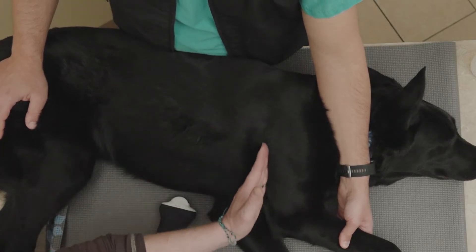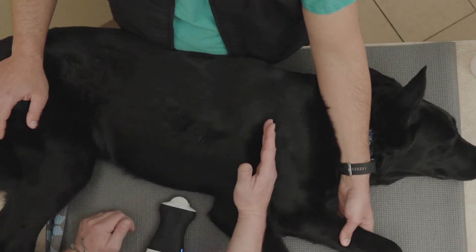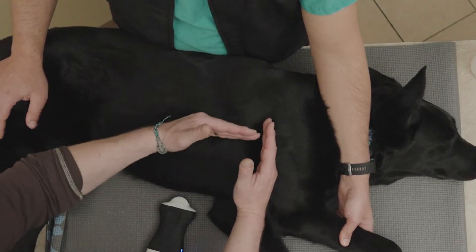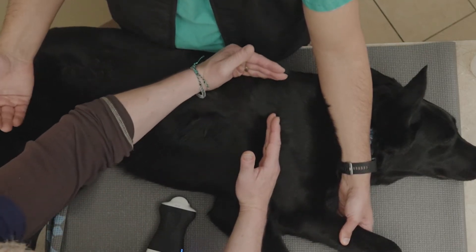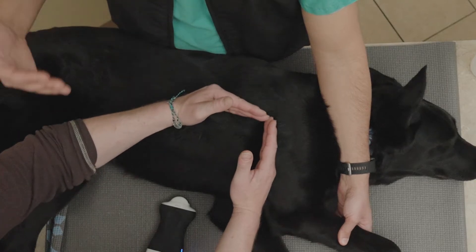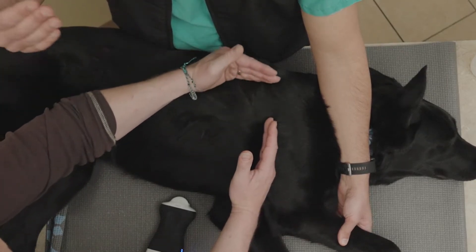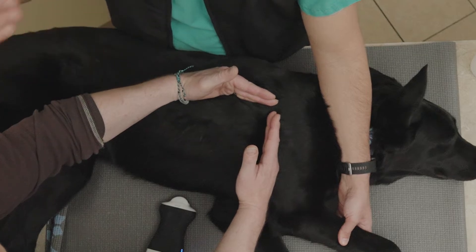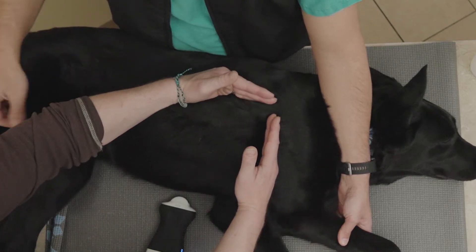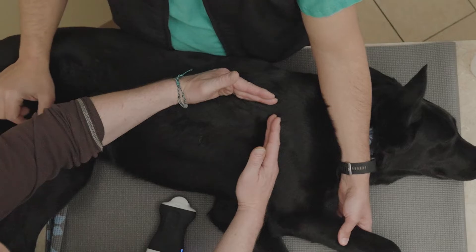That cranial border is a nice border to start with. We also have our dorsal border — you can't go beyond the epaxial muscles. Using ultrasound again, you can find this boundary because you're going to go from lung, lung, lung, to then muscle. So you know you're going to be at the most dorsal lung and pleural space boundary by finding that transition.